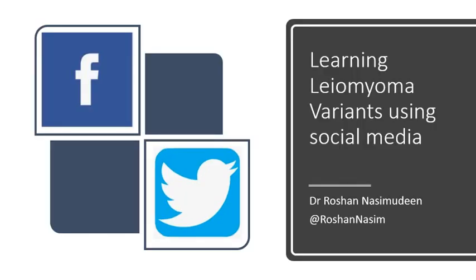Hey everyone. So we all know the impact of social media in pathology education and in fact pathology at large. And I was thinking, why not see the extent of it. And for that we'll take an example of Leiomyoma, in fact the variants of Leiomyoma, and go through the cases that people have posted in social media. And by social media I'm only focusing on Facebook and Twitter in this presentation. And all the cases will be those posted by people in the social media.